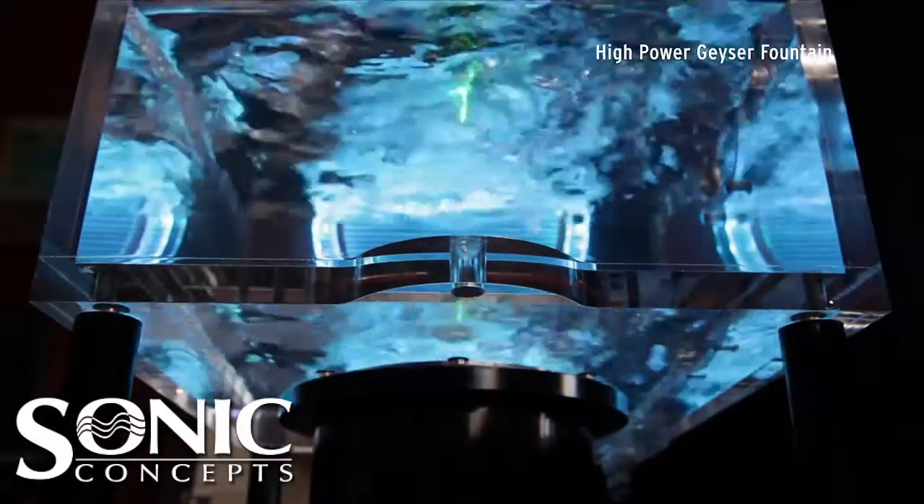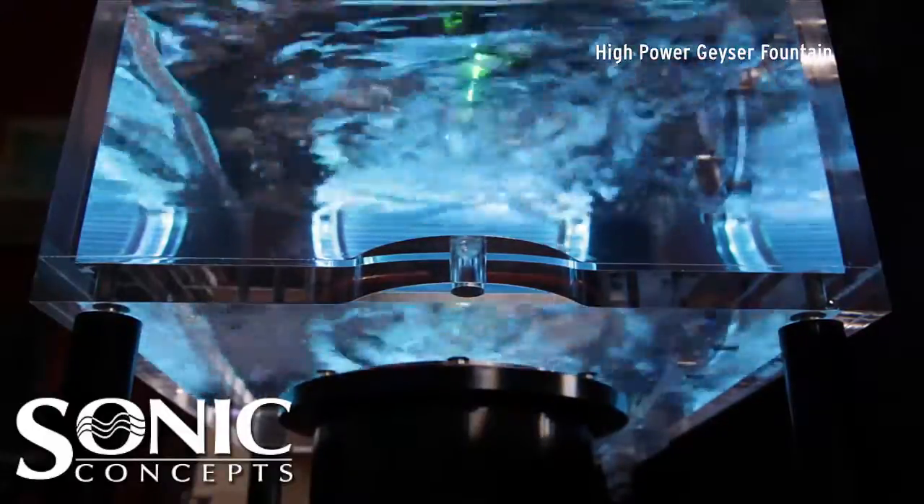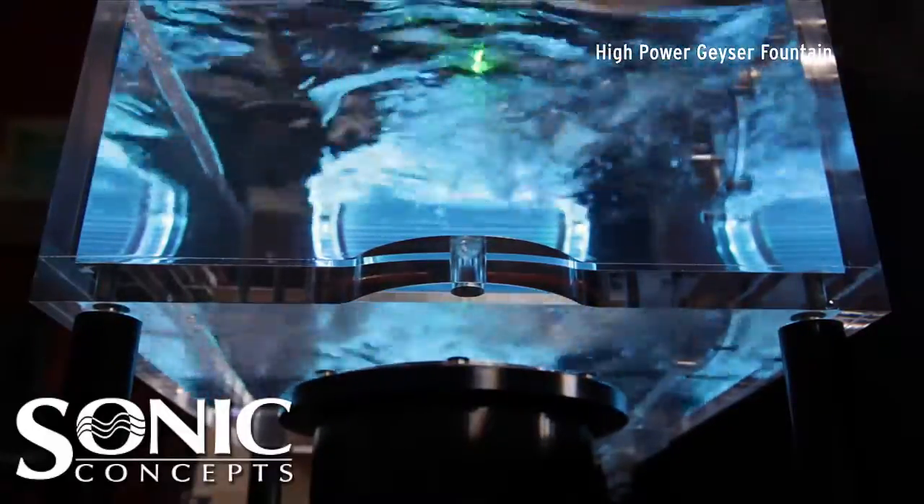Lastly, a view from underneath the water surface displays the jet displacement in combination with wave reflections within the water tank.